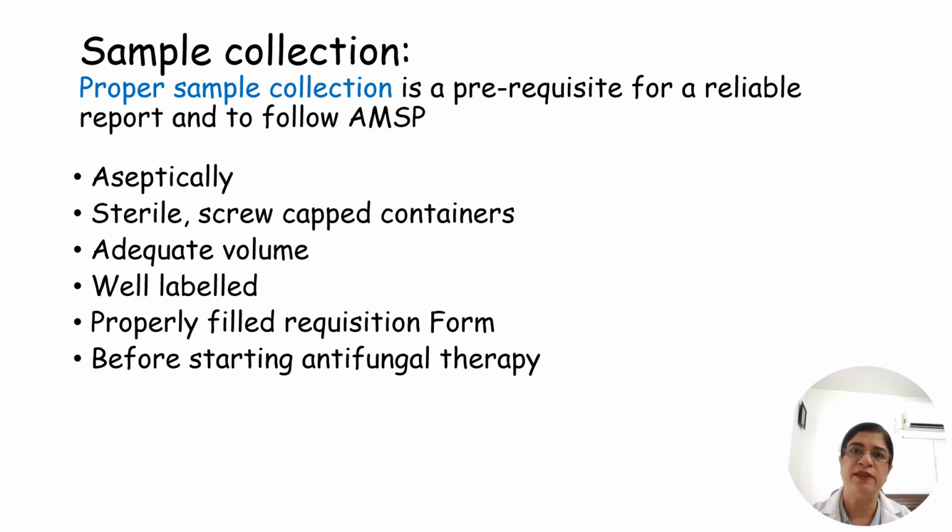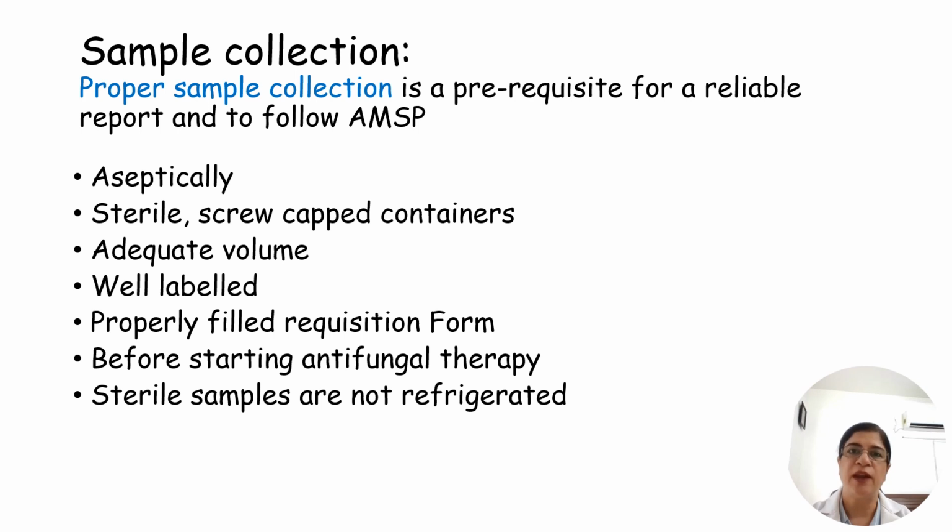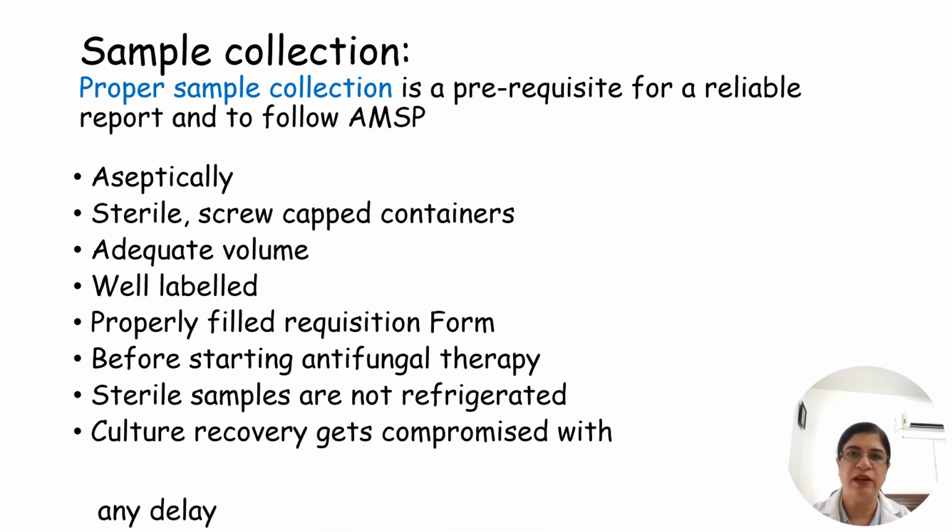Ideally, samples should be sent before instituting the antifungal therapy. Sterile samples should never be refrigerated, and if there is a delay in sending the sample, then culture recovery gets compromised.